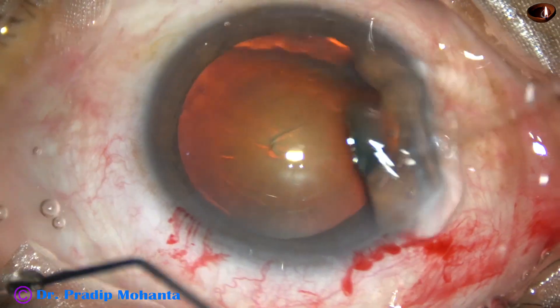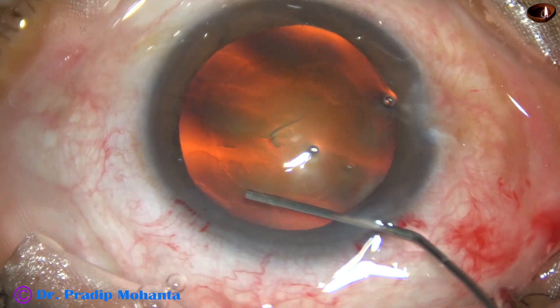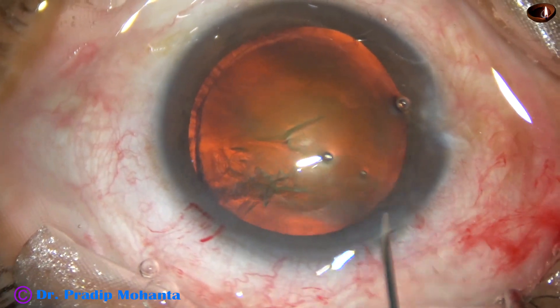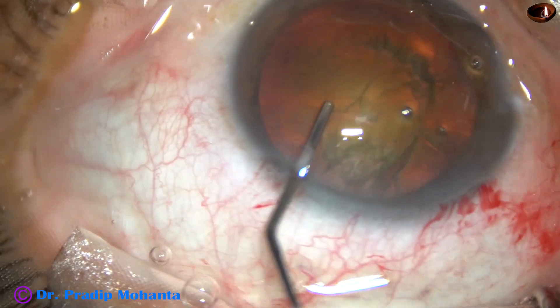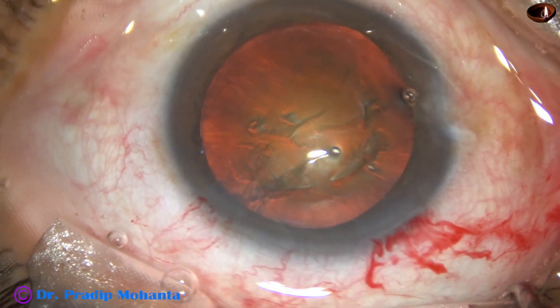Hydrodissection is now done. BSS is passed just under the anterior capsular rim. The fluid wave goes to the opposite side. Hydrodelineation is also attempted. The nucleus is elevated, mobilized, and rotated.